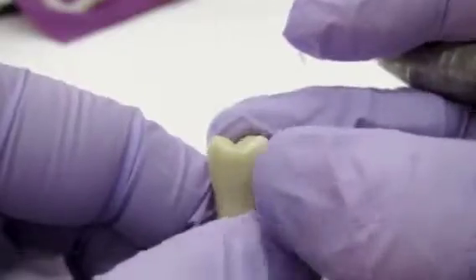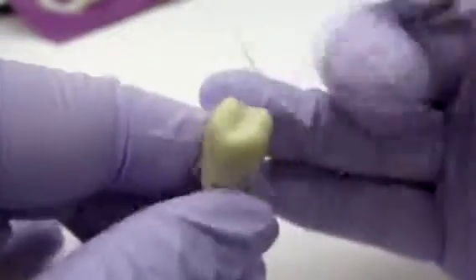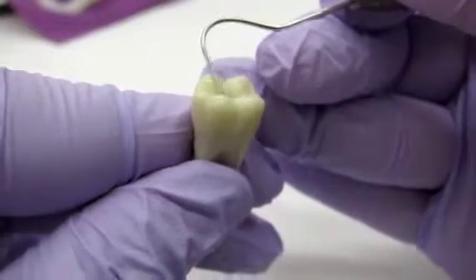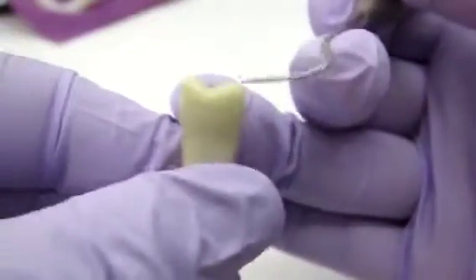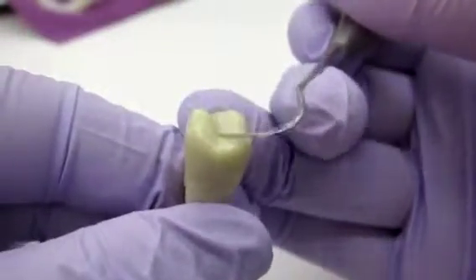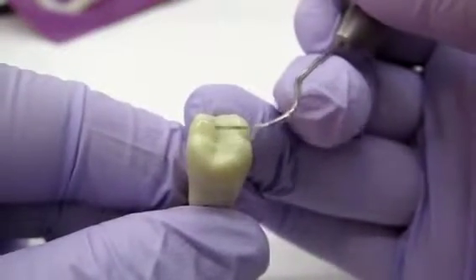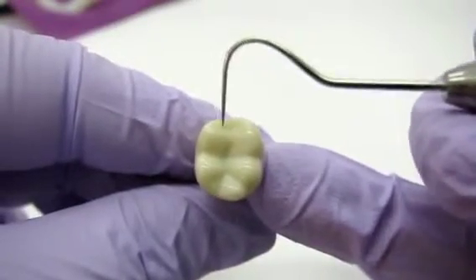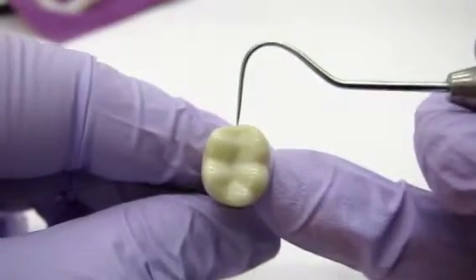The next thing you want to do is look at the cusps. The lingual cusps are more contoured than the facial cusps. If you look, they really do have a rise and a fall and give you that nice triangular ridge. On the other side, the buccal cusps are a little more flat — they still have a little bit of contour to them, but they're not as prominent as the lingual. Account for all five cusps, and account for these grooves right here. Especially because you're doing an M.O., you're going to want these grooves — that way it looks like a nice marginal ridge.